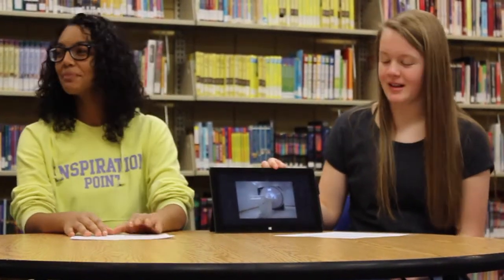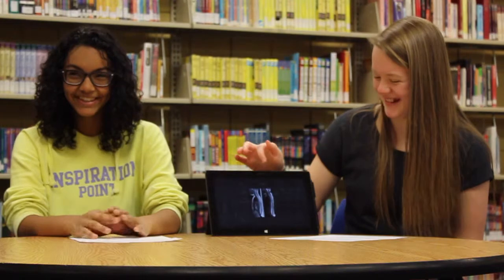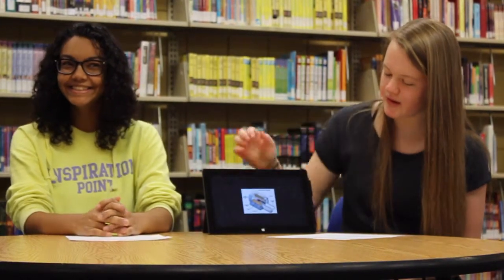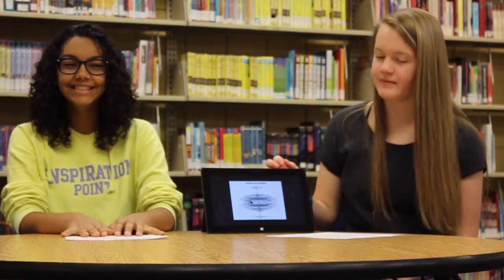This is an MRI machine. It's very small inside, as you can see, and you go in that hole and it takes your MRI. These are some images taken by an MRI of a person's spine and of a hand. And these are the different components of an MRI machine, such as the magnet. And this is the magnetic field of an MRI.